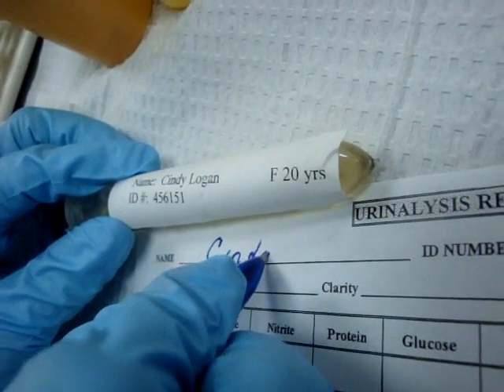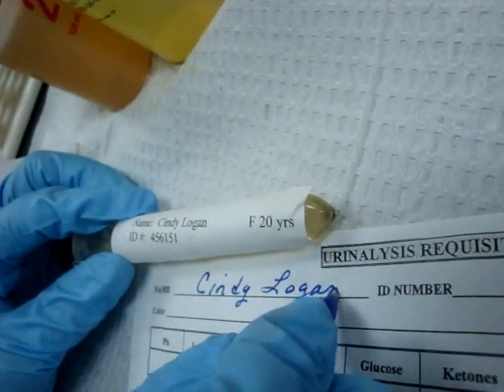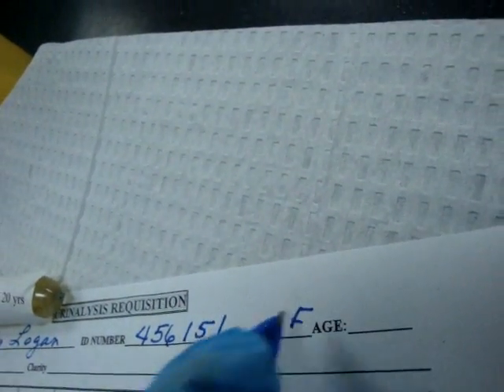Cindy Logan — her ID number is 456151, her sex is female, and her age is 20 years.